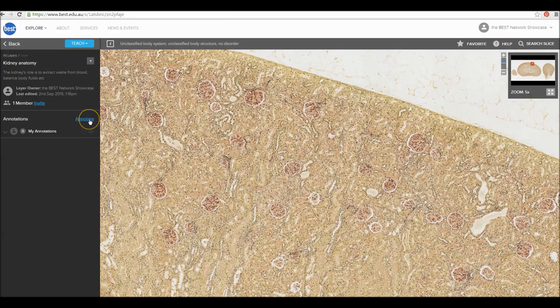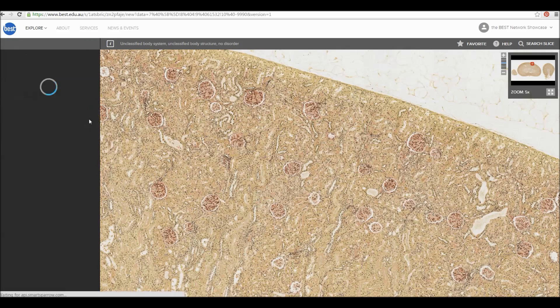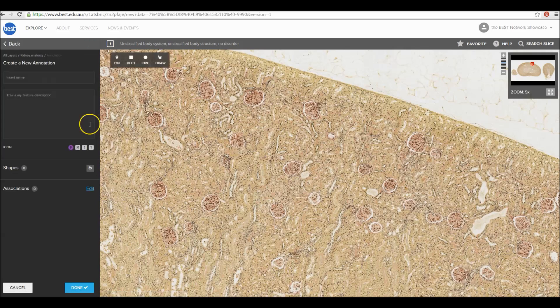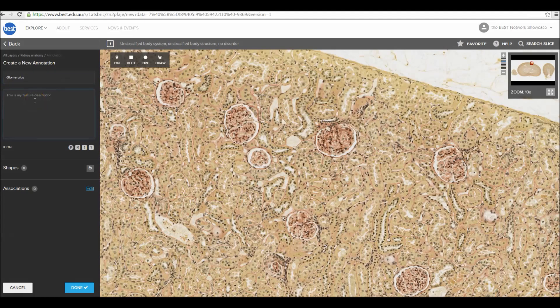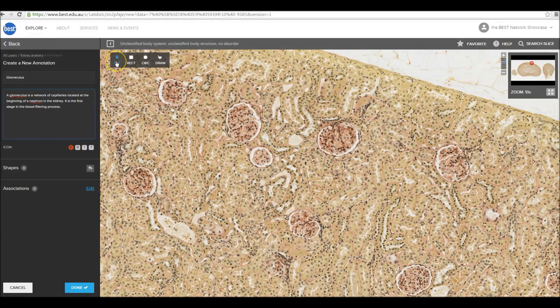Click Annotate to start marking features. You can add notes to each feature. An annotation can be in the form of a pin, a rectangle, or a circle.